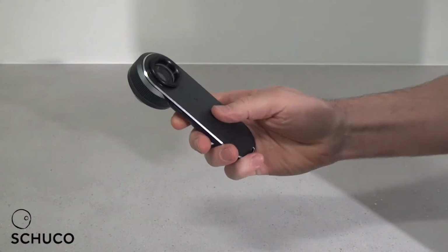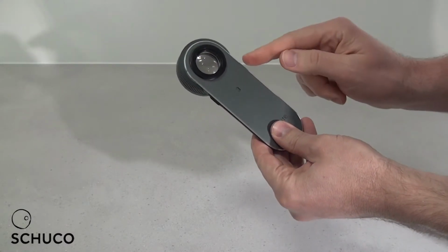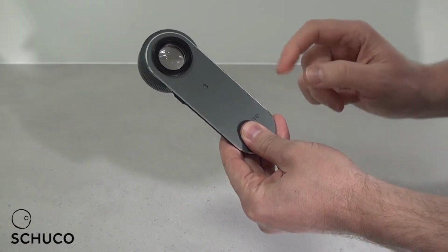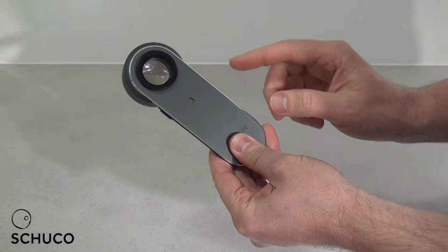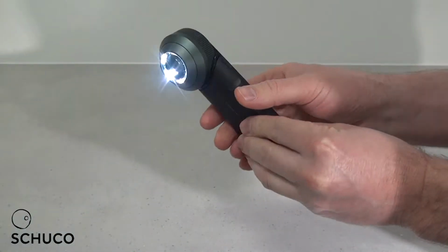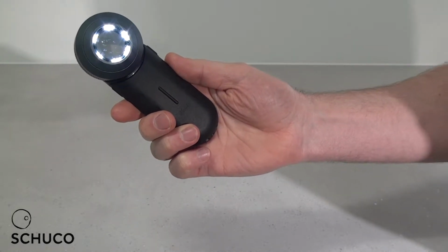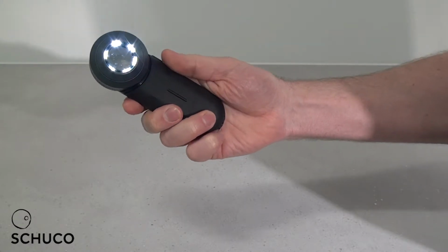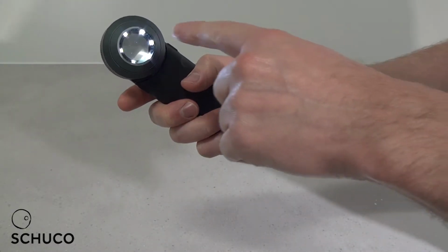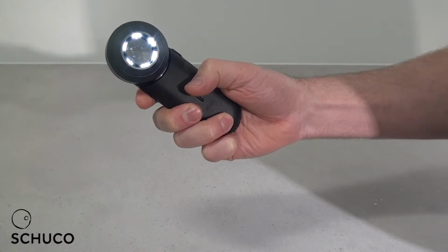So I'm now going to talk to you about how to switch on and off the device and the different types of settings on the dermatoscope. There are 2 buttons, one on the right, one on the left. The button on the right is the power button, and it also helps you switch between the 2 different modes of the dermatoscope. To turn the device on, you just simply hold down the right-hand button for more than a second. You'll see the light comes on here, and you'll see a circle of lights on the front of the dermatoscope. So this is the polarizing setting, and if you press the right-hand button again, just lightly tap it, it goes to the non-polarizing setting. For the teledermatology project, we want you to use the non-polarizing setting. You can see the difference of the lights. There are more lights for the polarizing setting.